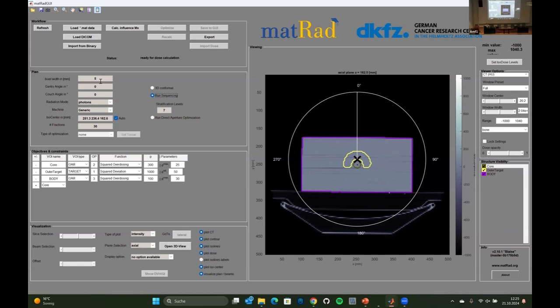Also in particle therapy, you could put in 1 million distinct spots, but then you need to compute 1 million distinct proton doses, and it will take ages. So there's a trade-off with the computers that you can actually use for treatment. That's also, for example, why VMAT came a little bit later than segmented treatment, because you need to compute a lot of intermediate beams for VMAT, and you need computers to catch up with what you want to do. So put it to 5.